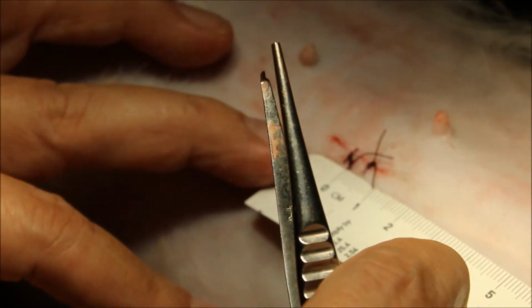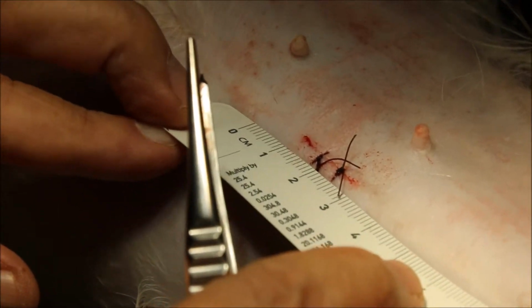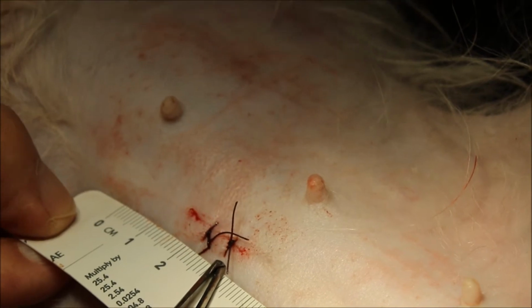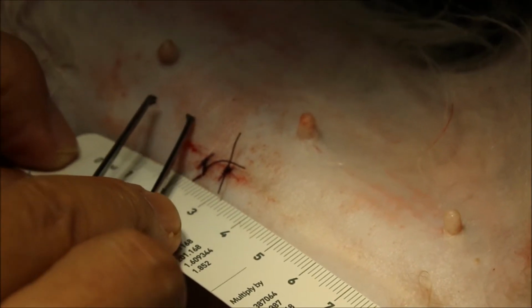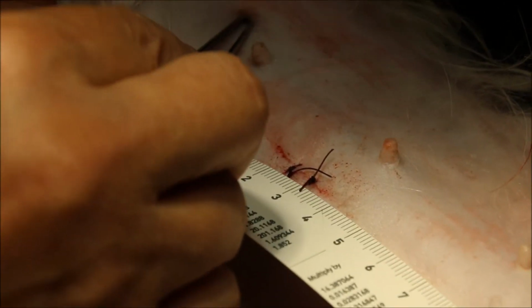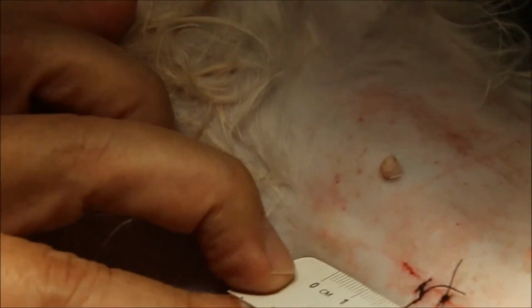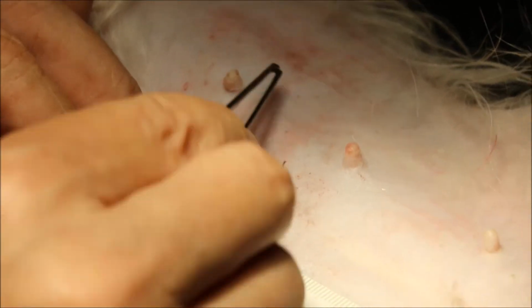Now some vets they cut a bit far, let's say instead of 2 centimeter. That applies to the cat also. They cut at 1 centimeter, or let's say they cut at 3 centimeter from the umbilical scar. So they cut here and then they cut this side. So that means the ovary is too far away. So when they pull to tie the ovarian ligament, the whole ovary breaks. When it breaks, of course, the ovary drops in, and it's really a big thing, because that means the dog will come into heat again, because the ovary has dropped in, and then the vet completes the surgery. Now that is no good for the owner and for the dog, because the dog will keep cycling because of the ovarian tissue.